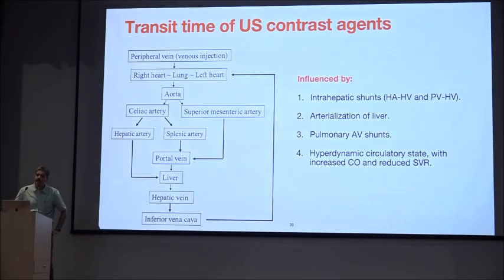So what really excites me is that we can now estimate the hepatic vein pressure gradient, at least CSPH, non-invasively. And we use this very often in the department: the transit time of ultrasound contrast agent. So just bear with me.